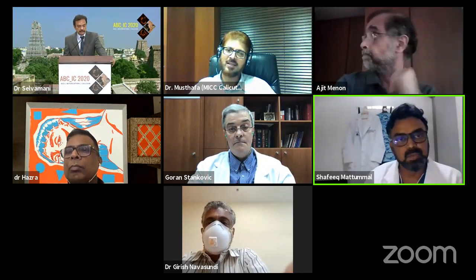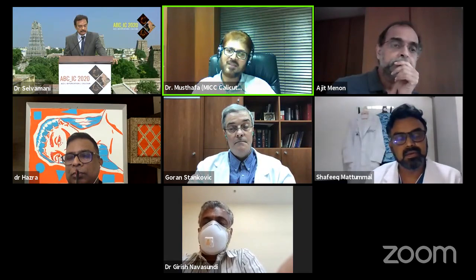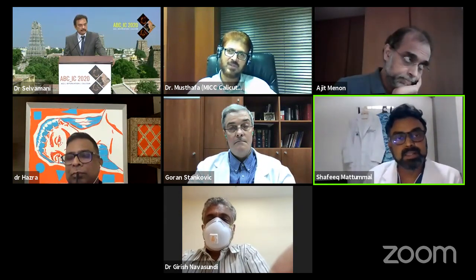Okay, you first inflate the side branch balloon, that is the jailed balloon, and then you keep it in an inflated position and then deploy the stent. Then after that, deflate the side branch balloon and remove it, and then deflate both. Then reassess and do the POT.